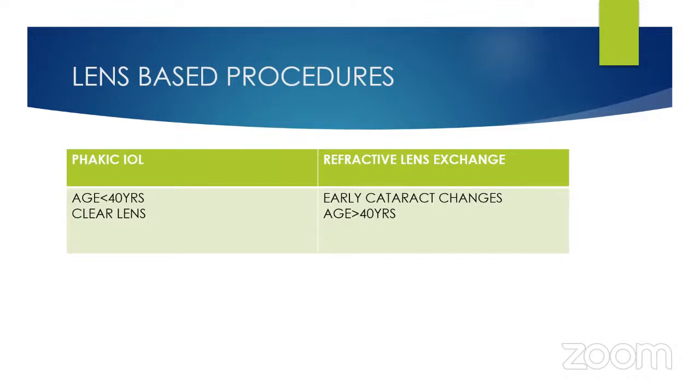Namrata, are you there online? Yes, sir. Can you tell me what the flow chart is for this patient? We will first assess the grade of myopia and hypermetropia he has. Accordingly, after Pentacam, if the cornea is normal and the patient has no risk of trauma, we can go for a flap-based procedure. Otherwise, we consider PRK for refraction.